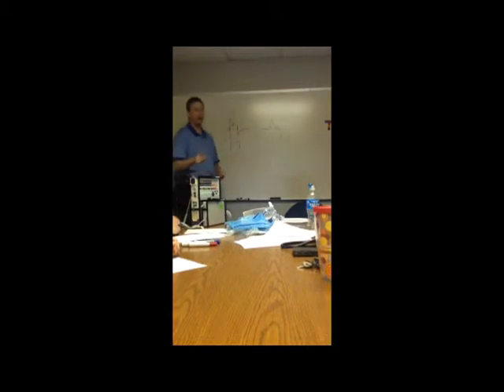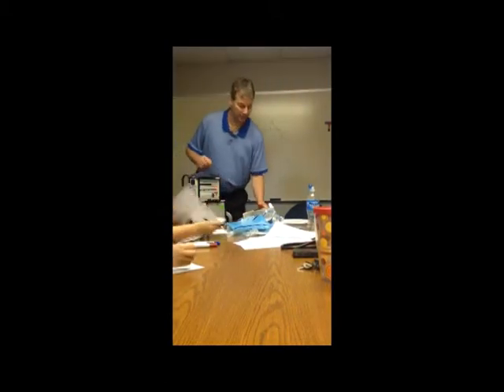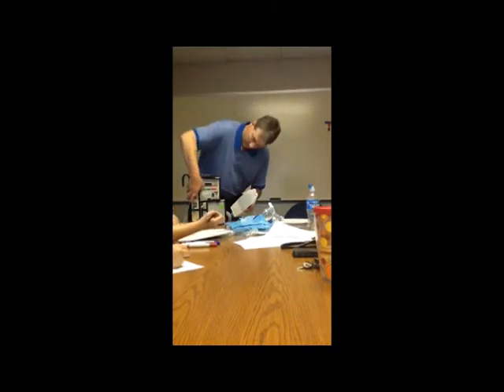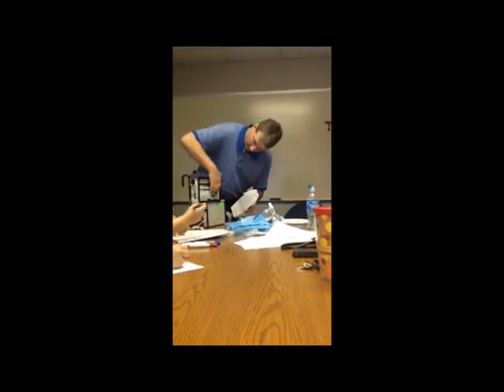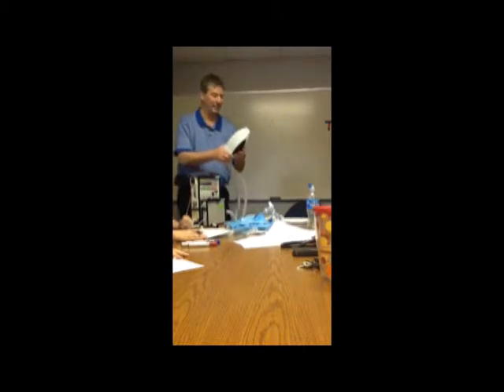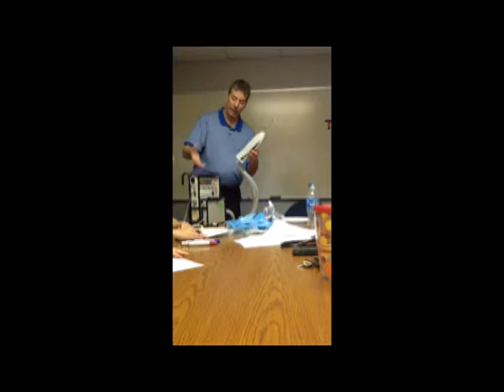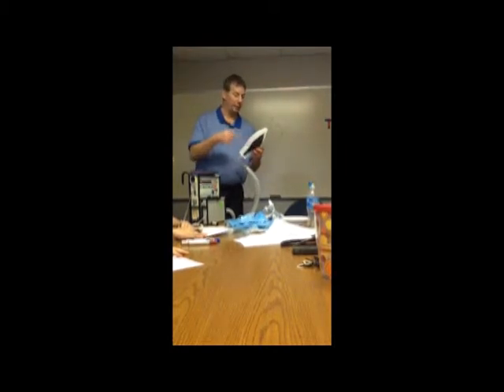In assist control, the only other type of breath that happens in assist control, I'll show you here. I don't know how much this lung will take, but we're going to make it get big. All right. I want you to be able to see the difference. So it's breathing, if I don't touch it, 8 times a minute, 650 in each breath.